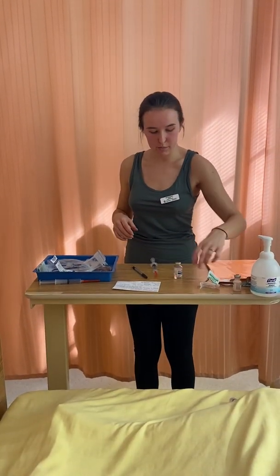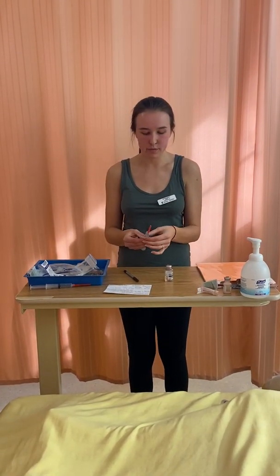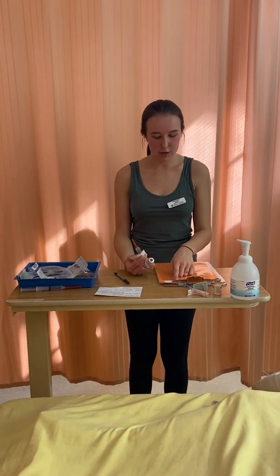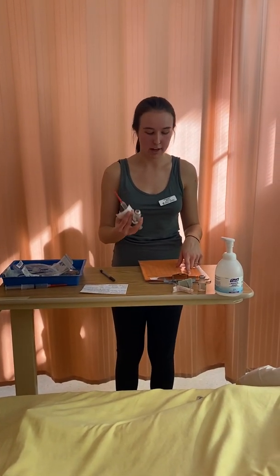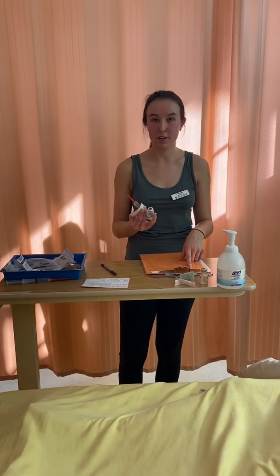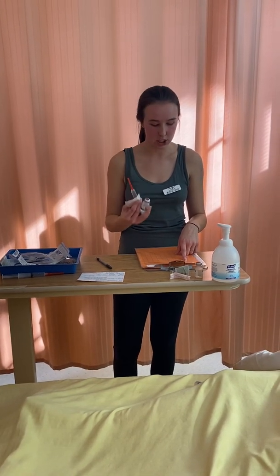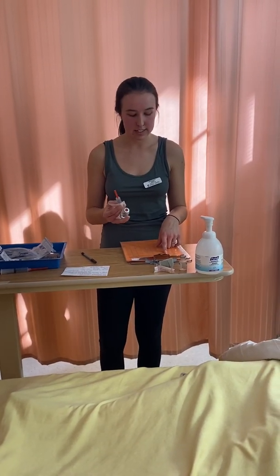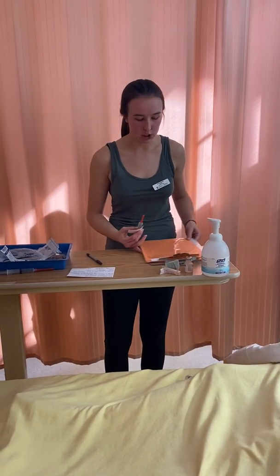I have my medication in my syringe, along with a label I have previously created and my MAR. I'm going to do my second check. My right patient is Fiona Friedman. My right medication is vancomycin. My right dose is 500mg — based on my concentration of 50mg per ml, 500mg is 10ml, and I have 10ml in my syringe. The right route is IV. It's administered every 12 hours with the dose due now. I can now put my medication away.